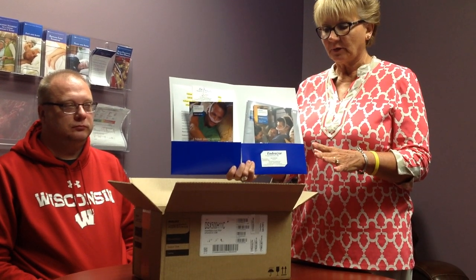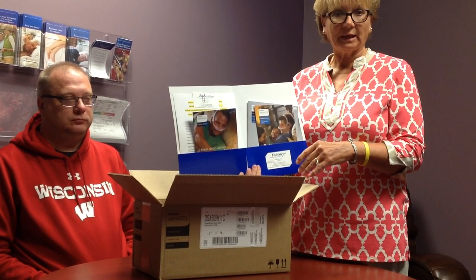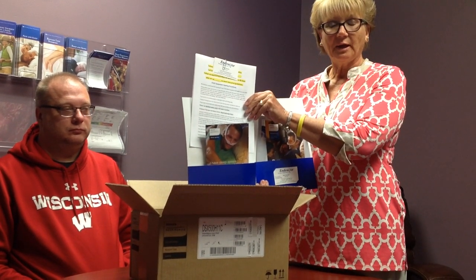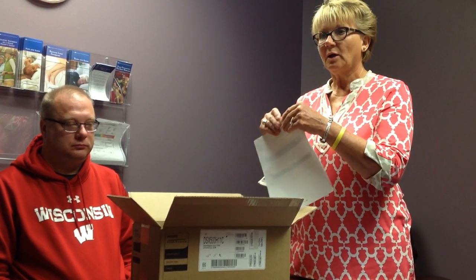We're going to go through first your mask fitting, then the operation of the machine, and after that we will go through cleaning of all your supplies. There's also a cleaning sheet for you to follow — everything I say is pretty much going to be on that sheet. Also in here is a sheet for the Dream Mapper software. There's a card attached here with me and our phone number so you can give us a call with any other issues. We are also sending an email over to you with some instructional videos to help you.